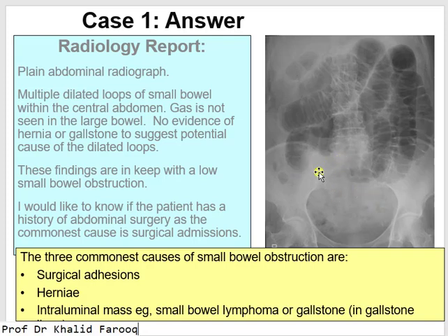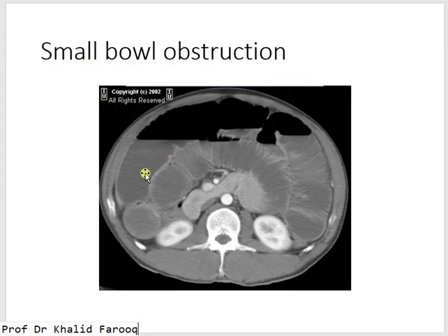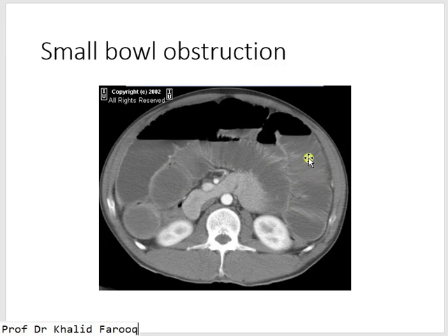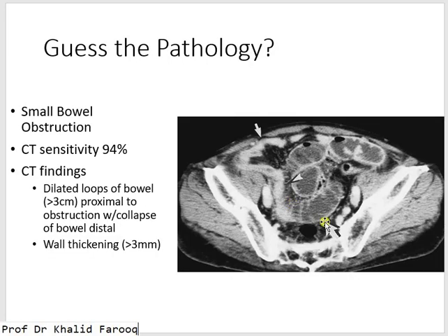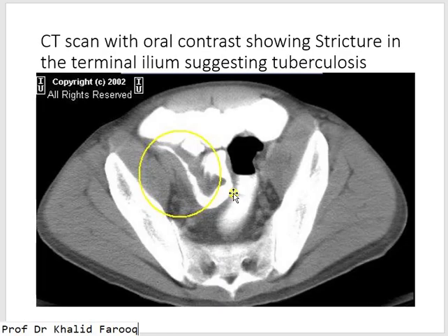On CT examination of the abdomen, both kidneys show normal uptake of contrast. This is a contrast-filled aorta, superior mesenteric artery and vein. We can see dilated small gut with complete mucosal folds and air-fluid levels suggesting small intestinal obstruction. Another example shows the exact cause: a stricture in the terminal ileum caused by tuberculosis, with the proximal portion of the small gut dilated — clearly identifying the etiology.